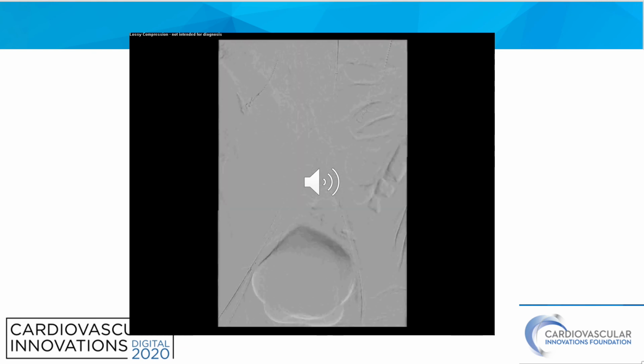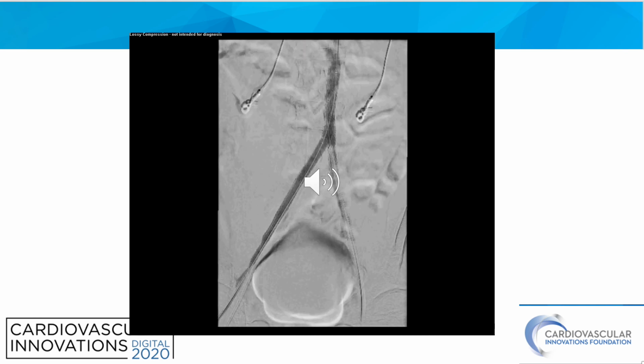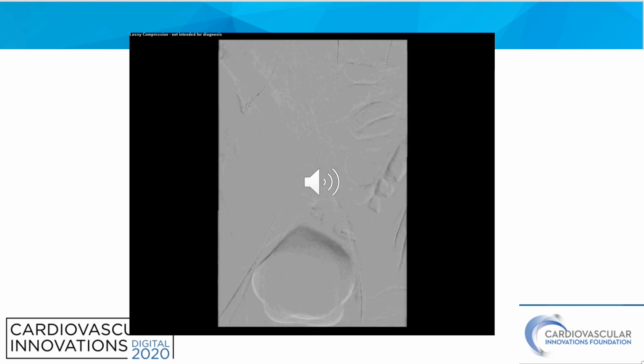As you can see, placement of this stent graft quickly took care of the rupture, and the patient quickly became hemodynamically stable with fluid resuscitation.